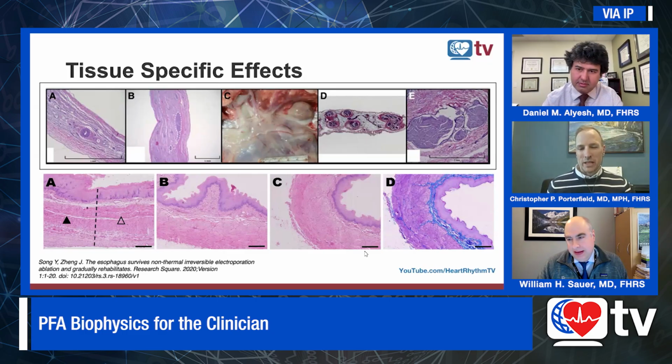Blood vessels also tend to be less burdened, although we see the coronary spasm effect and the spasticity of the vessel. Although it doesn't occur every time, we see it, and we often preventatively give medications to prevent spasm. So all in all, it's interesting because we're fortunate to have that sparing of the tissues that we don't want. Whereas some of the other effects, which we'll talk about with hemolysis and some of the microbubbles, we'll discuss in a little bit.